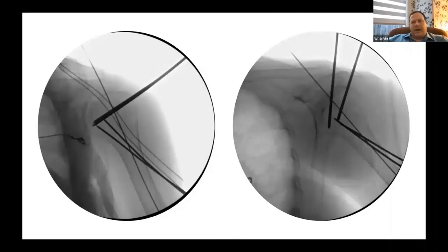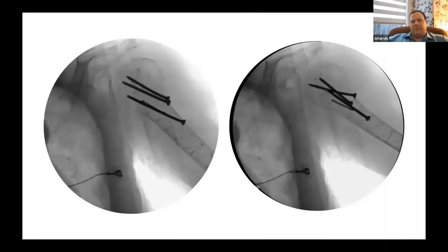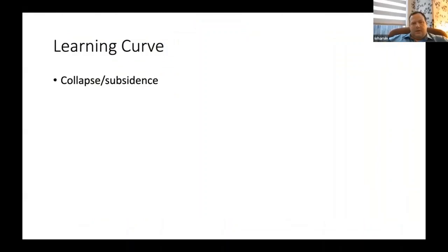From a center-center start point, I dropped the guide wire down, followed by the sheath and balloon, then insufflated monomer into the balloon. Going back and forth between the fluoroscopy shots, increasing monomer amounts distracts and improves the alignment. You do have to be careful — if you continue adding monomer, you can over-distract the fracture, which is not great. I supplemented this fixation with percutaneously inserted screws. Post-operatively and at six weeks, for a six-week proximal humerus fracture follow-up, I think this is a fantastic result.